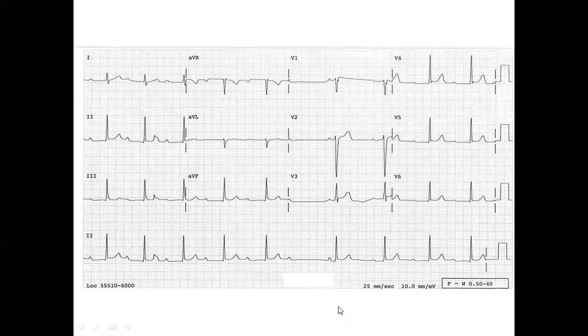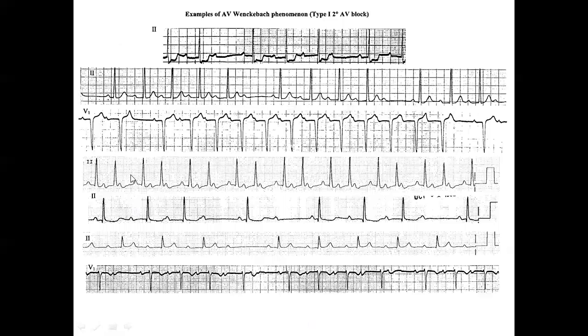Okay, let's see a typical example of a Wenckebach phenomenon. The PR lengthens and it's blocked, and always the first RR is longer than the subsequent RR. Some more examples. So the first one is always longer than the next one, then of course a pause.